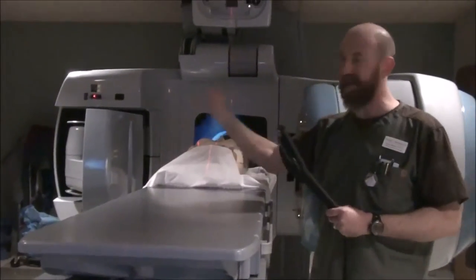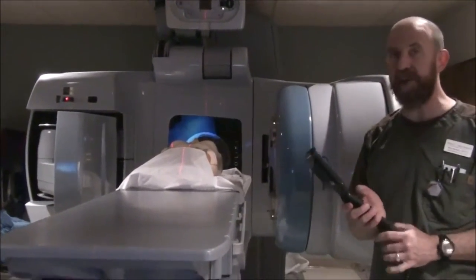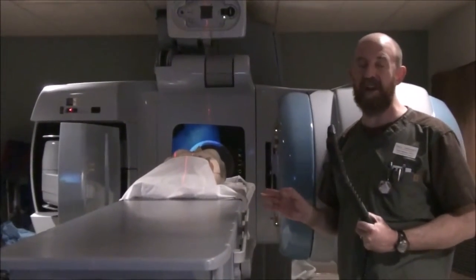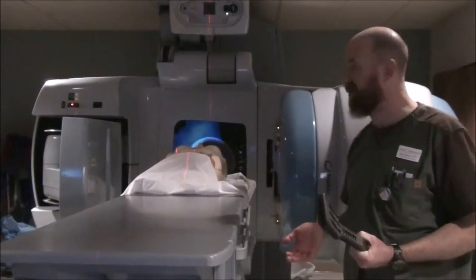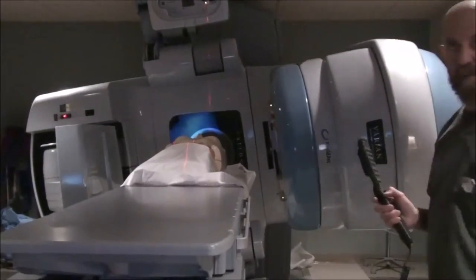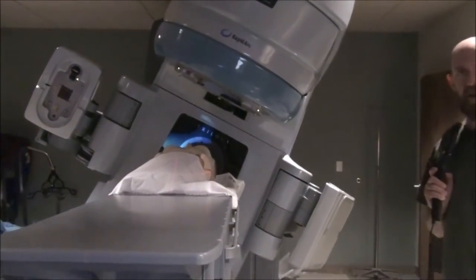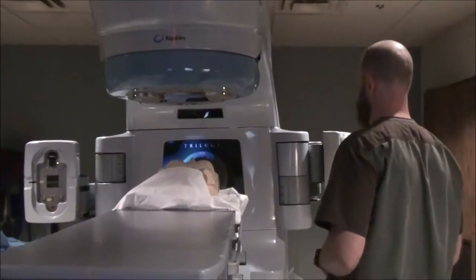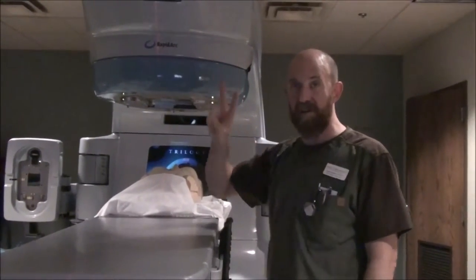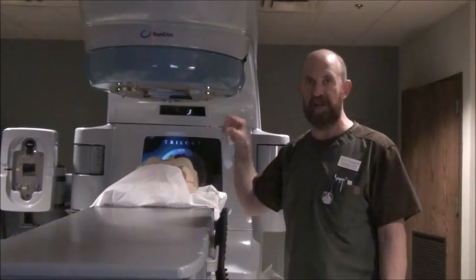Center your image intensifier, set your TFD, put your marker on, and take your film. What I usually do — taking a bit of a chance — is take an anterior and a lateral and get them approved at the same time. You're taking a chance that the doctor won't like one of them and you'll have to redo the whole thing. Nine times out of ten on the pelvis they don't do that. So I'll take the lateral film, set it aside, rotate up, read the SSD, take the anterior film, and run both. Once he's approved the films, I come back in and take my right lateral and PA, reading the SSD for each, and run those two. Now you've got all four films taken and run.